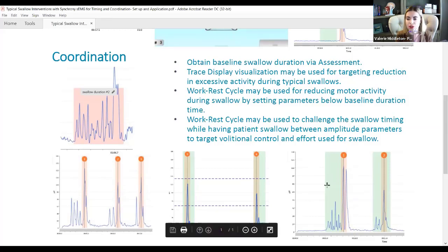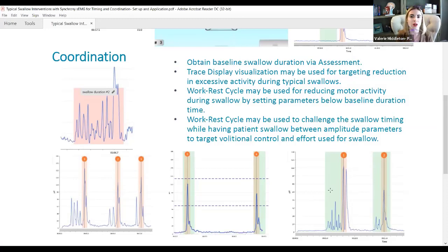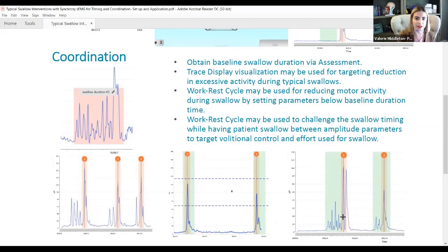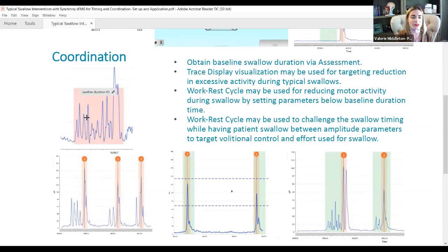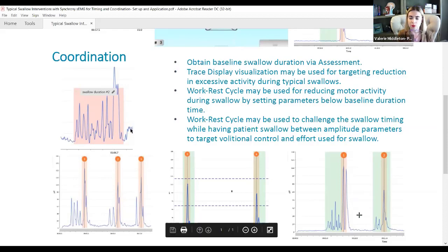We can also work on swallow duration. Instead of just addressing delay in initiation, we address the case where a patient has initiated a swallow but has excessive movement before and after — all counted as their swallow duration. You would have noticed this during your assessment. In an example where swallow duration appears to be about eight seconds, we see a lot of effort and excessive movement to get the swallow initiated, and the patient doesn't quite return to baseline afterward.